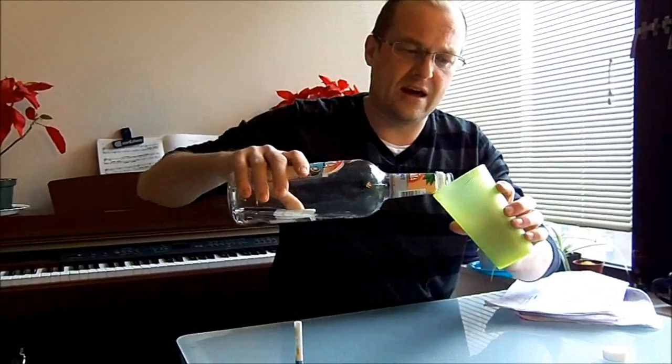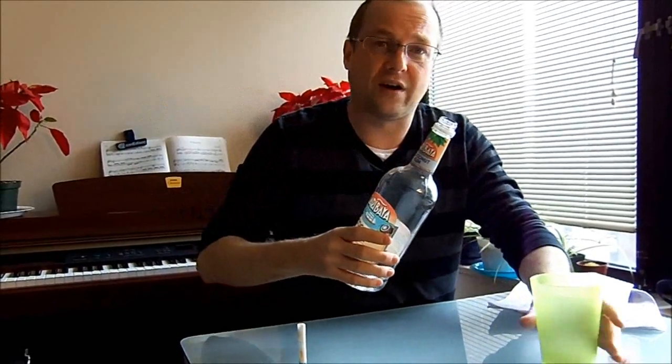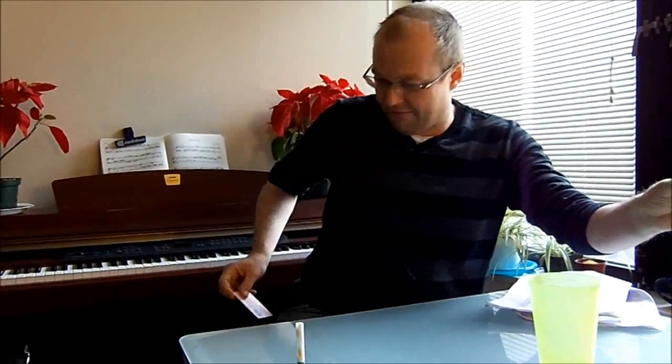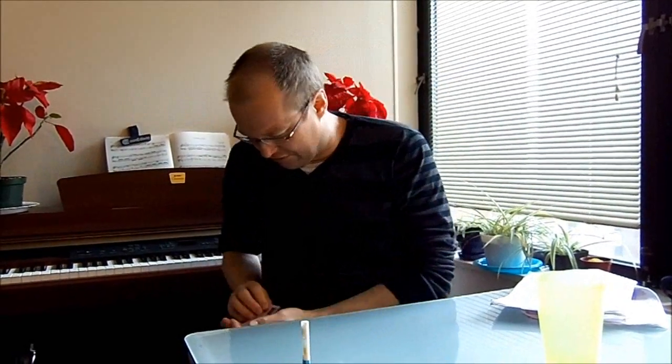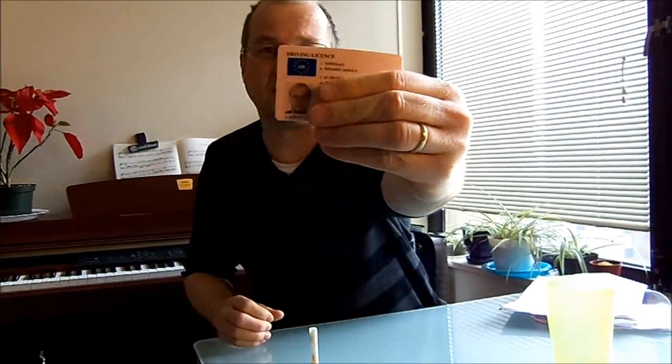I'm going to pour it into here. Now I'm not going to get drunk, I'm just going to swirl it around my mouth to try and give me elevated alcohol levels. I am of age, just show you my driver's license. There we go. And I did also have hair previously.